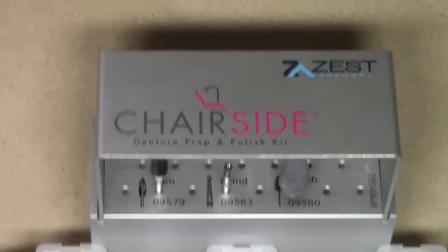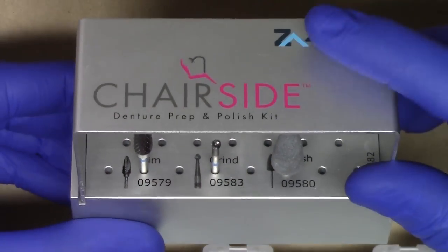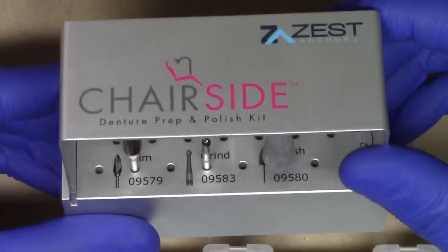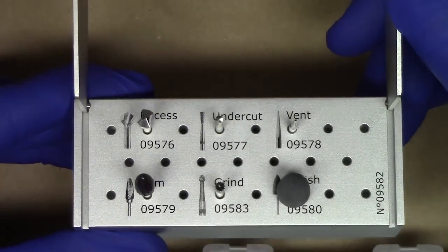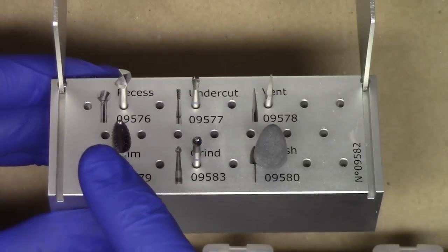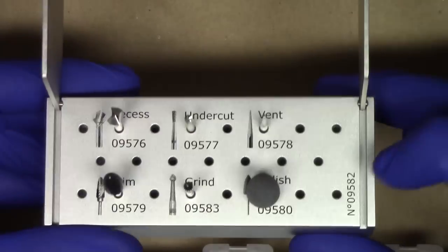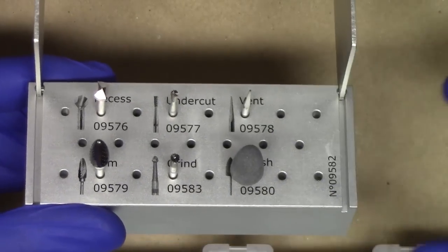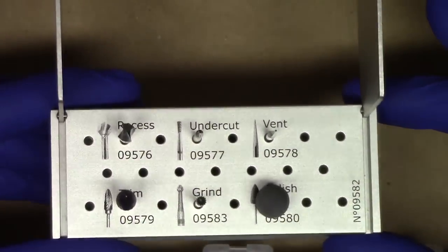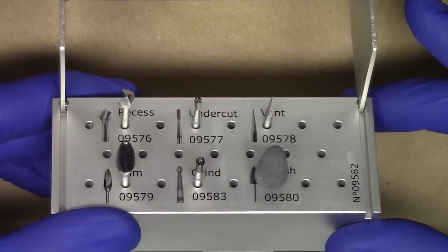As I zoom in, the first thing you'll notice is that the burr block has a very nice attractive design with a premium feel to it. Included in this burr block is everything that the clinician would need to process either a locator or Saturno denture cap into your existing complete denture. As I open the burr block, you'll notice you have six burrs of varying names and different designs. The top three burrs are your preparation burrs and the bottom three burrs are your polishing burrs, used after you have attached your locator denture cap to the denture. Additionally, Zest Anchors has given you the option of including some favorite burrs you might want to use for any sort of conversion, with additional holes on the side for those burrs as well.